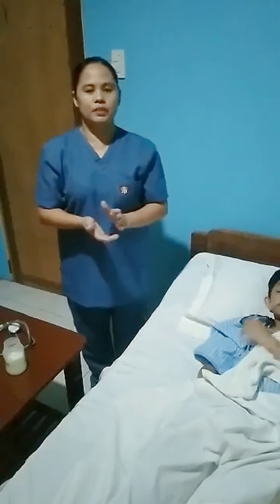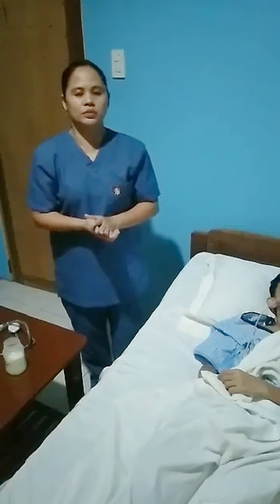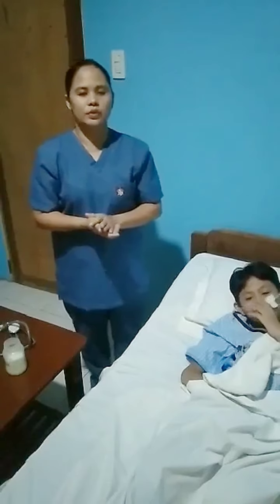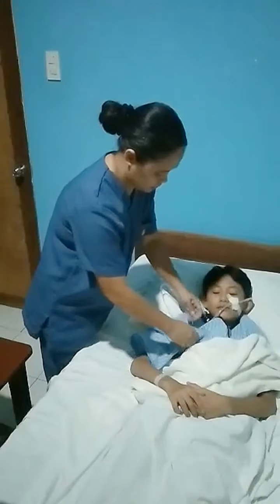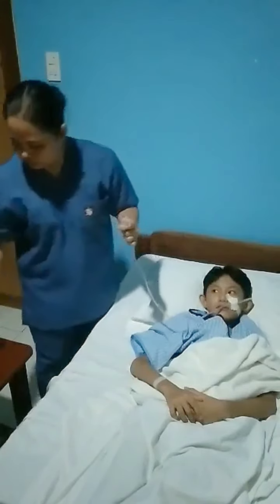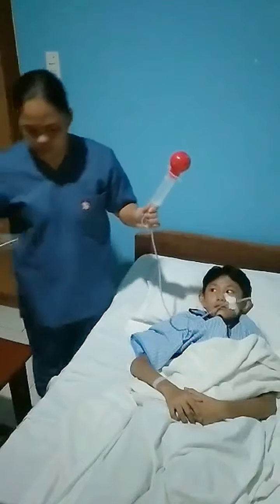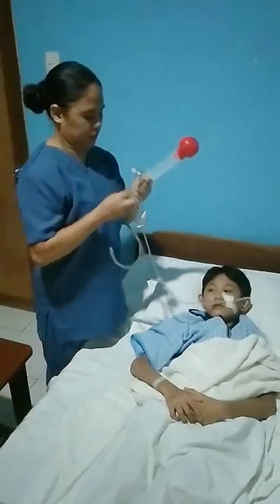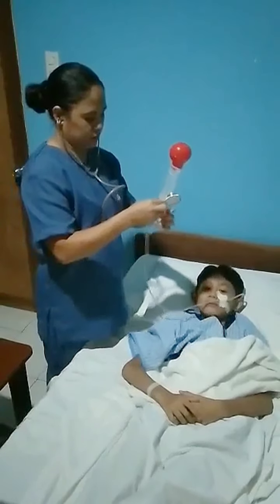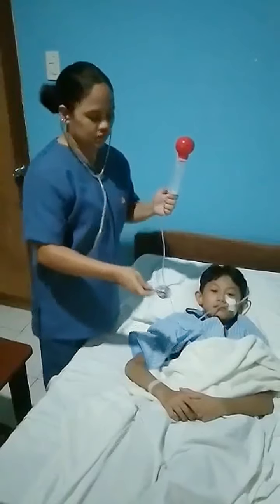To auscultate for the whooshing sound, we have to make sure to kink the tube, open the lumen as we insert the syringe, put the stethoscope, and then pump or introduce 5 to 10 ml of air. Place the diaphragm over the epigastric area.